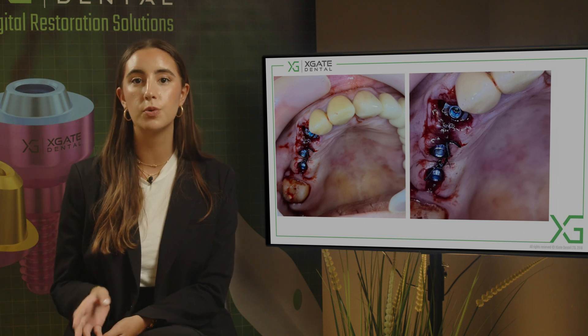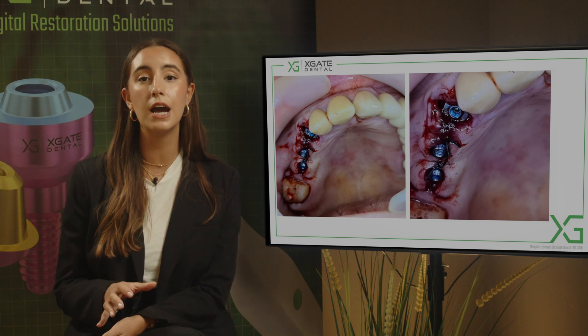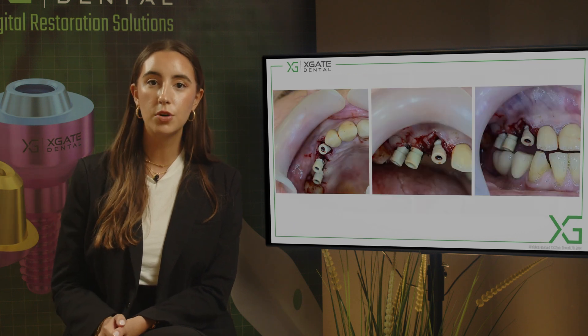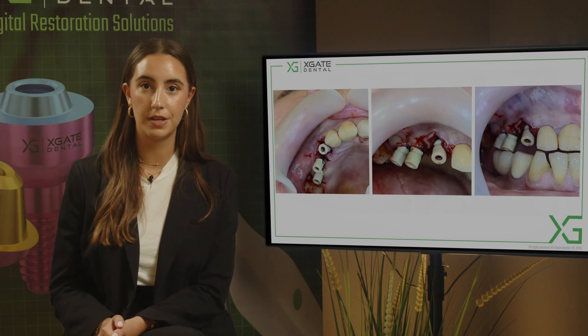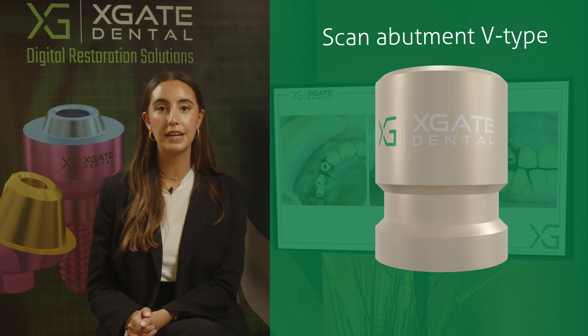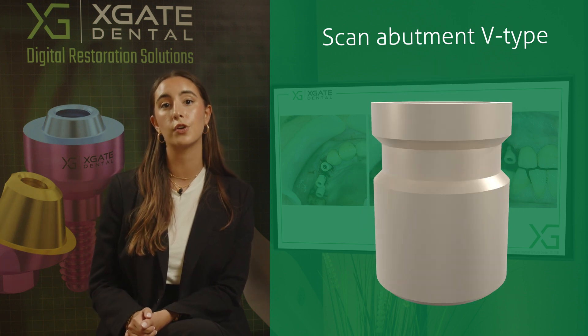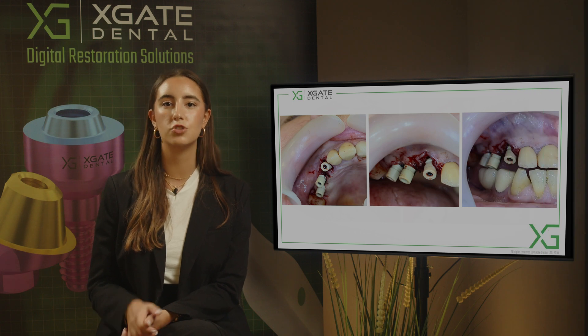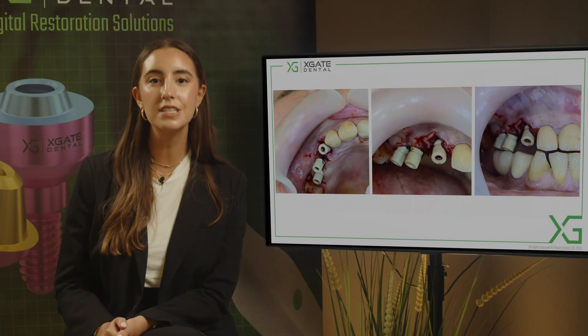On top of the implants we place the multi-units, and then we take impressions from the multi-unit. Into the multi-units we attach the scan abutments, and you can see that the height of the scan abutment is much bigger than the height of the tooth that will be on the crowns. The teeth themselves are very small because she grinds her teeth, so we place three scan abutments.